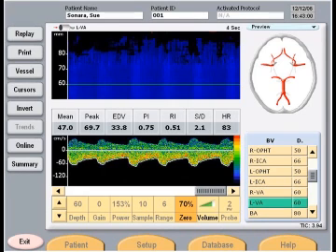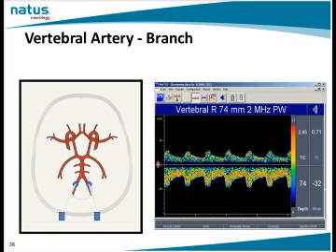We see color filling in our M mode all the way from 60 to about 80. This tells me, by this M mode being filled here, that I am going to be able to trace my vertebral artery from 60 at least towards 80. And you want to do that. So take a picture at 60. Take another photo deeper within the vertebral. I usually take one myself about every 10 millimeters unless I encounter pathology.